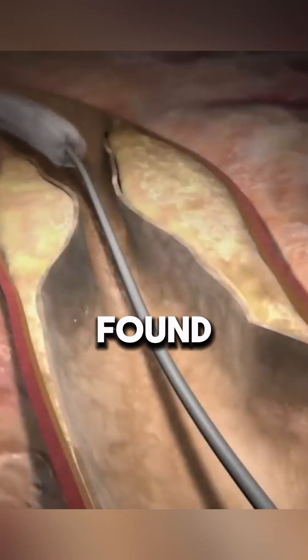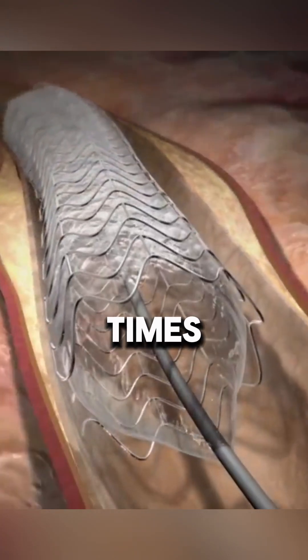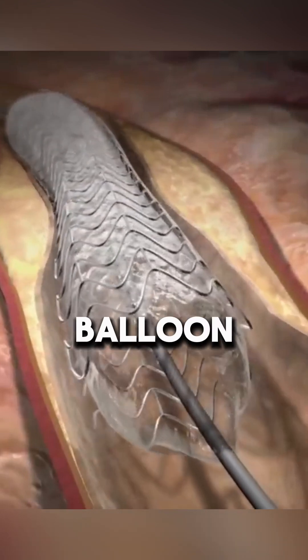If a blockage is found, a small balloon with a stent is inflated at the site to widen the artery. It may be inflated several times to push plaque against the artery walls.